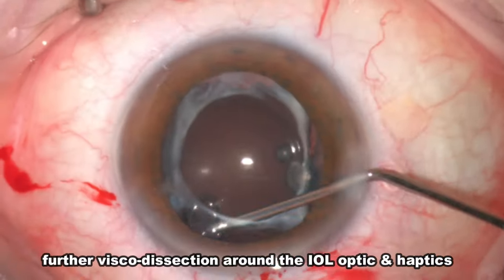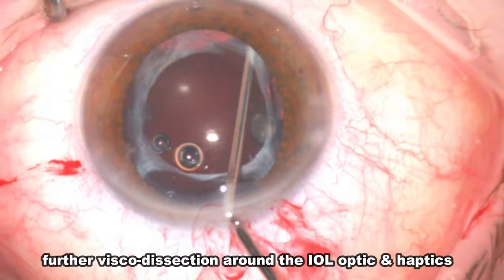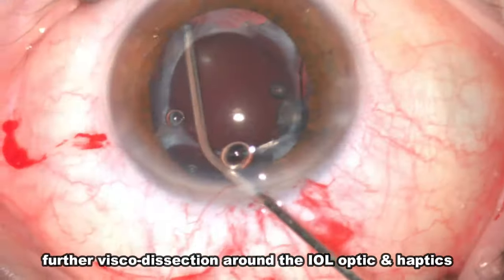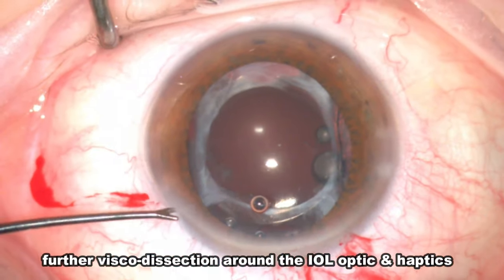It is important to be generous with visco-dissection to completely free the lens optic and haptics from the capsular bag and minimise any zonular trauma on the already compromised capsular bag.